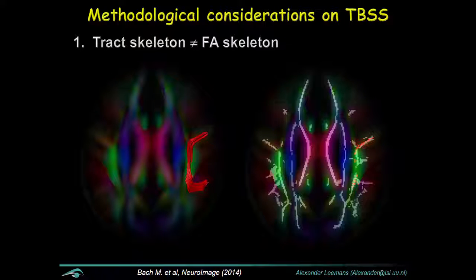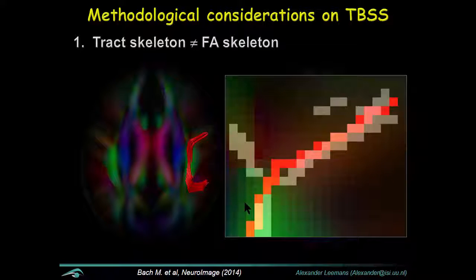And you can do this even from an image processing point of view. You can actually calculate the tract from the template and overlay the tract skeleton from this tract with the FA skeleton in white. Okay, and you can see while they have some similarity, they're definitely not the same. And this is kind of expected. Again, orientation information is not captured in the FA itself.